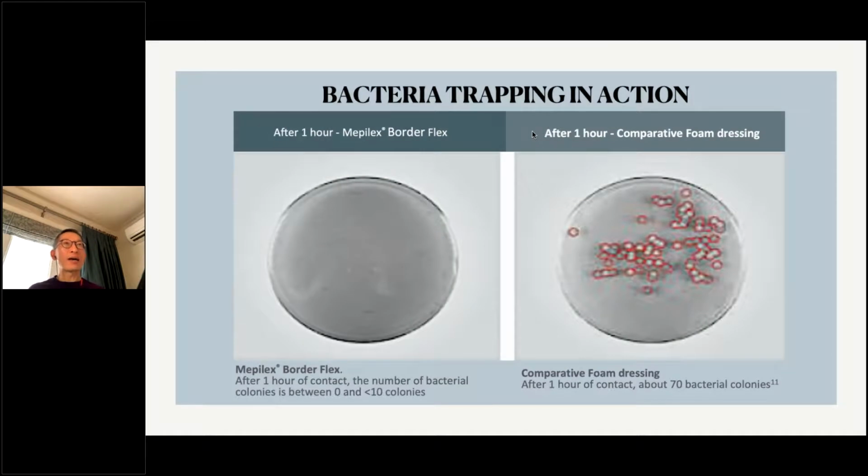So the other important component is that, because of the ability of the foam dressing material to lock the fluid in the dressing itself, there's a thinking that once you lock the fluid, you also sequester a lot of the bacteria along with the wound fluid inside the dressing as well. And this is what we call the bacteria trapping action.